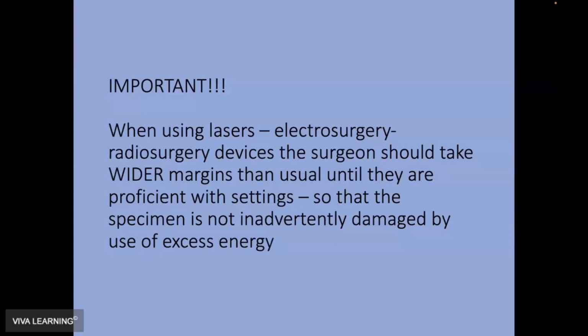Important. When using lasers, electrosurgery, radiosurgery devices, remember, take wider margins than usual until you're proficient with the settings so the specimen is not inadvertently damaged by use of excessive energy.